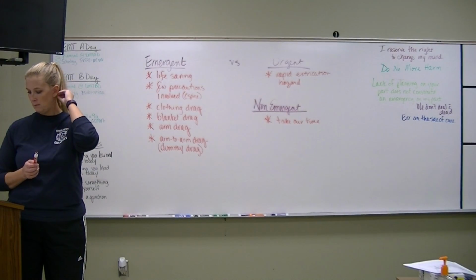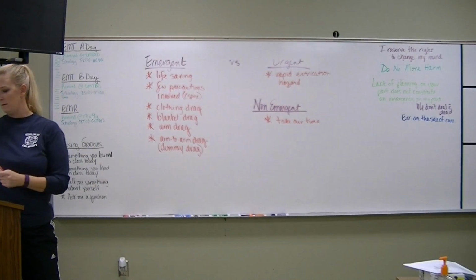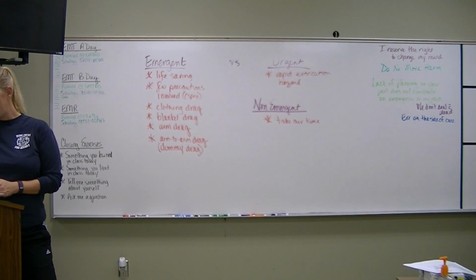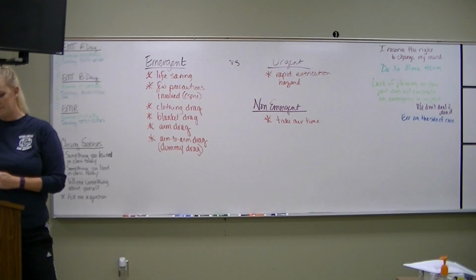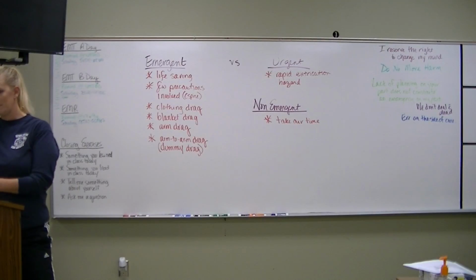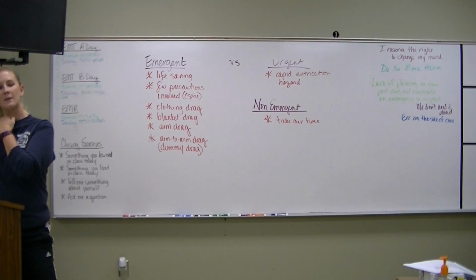Just on the stretcher. I mean, if the patient walks to the stretcher and then we wheel them away. Okay? Or you take the time to use the KED board, KED device, or any of the other things that we do. We're doing it with the full precautions. Yeah. Full spinal immobilization. Okay?